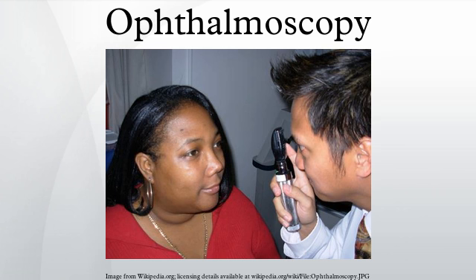History: Dr. William Cumming in 1846 at the Royal London Ophthalmic Hospital, of his pioneering work wrote, "Every eye could be made luminous if the axis from a source of illumination directed towards a person's eye and the line of vision of the observer were coincident." Although some credit the invention of the ophthalmoscope to Charles Babbage in 1847, it was not until it was independently reinvented by Hermann von Helmholtz in 1851 that its usefulness was recognized. It was to revolutionize ophthalmology.